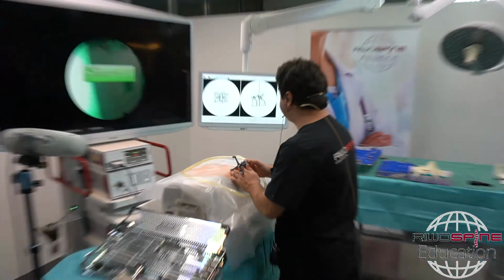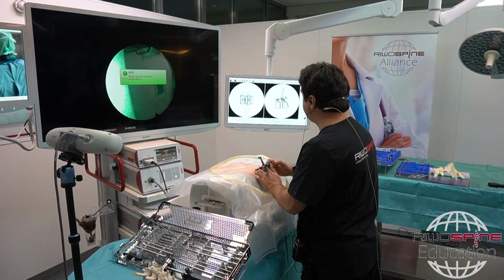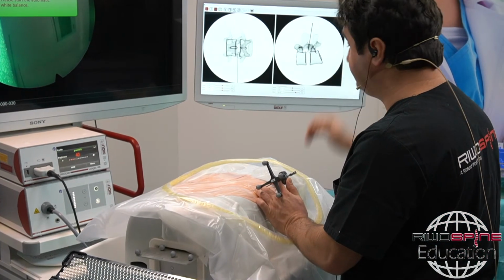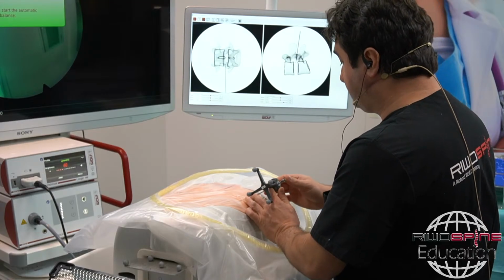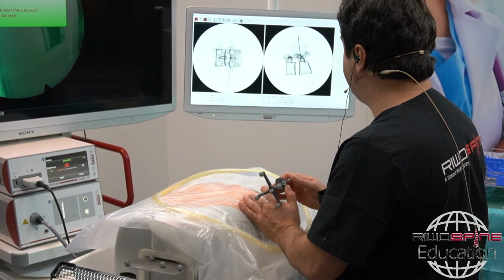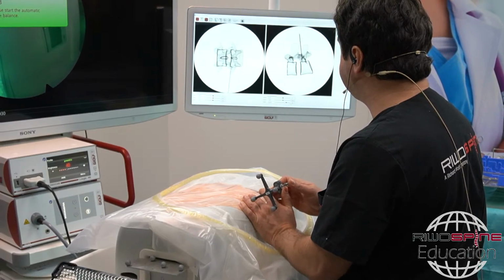If we see enough space, then you can dock on the annulus. You can start at the medial pedicle line and the annulus, and at the end, you can pull the system back and rotate to the cranial side. But if you don't see any free space due to the herniations or something like that, then you have to start like this from the bone.